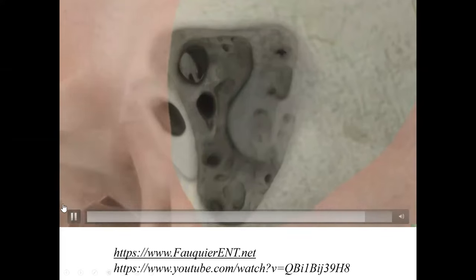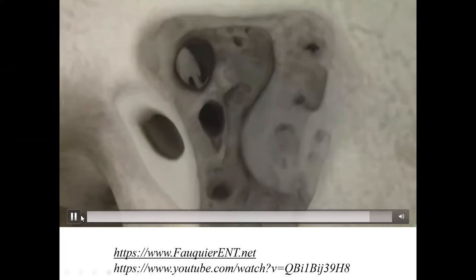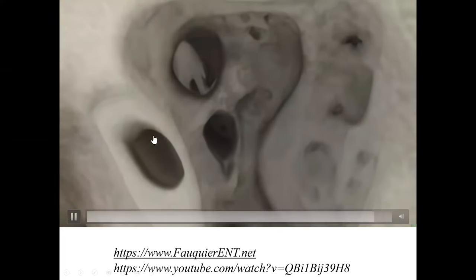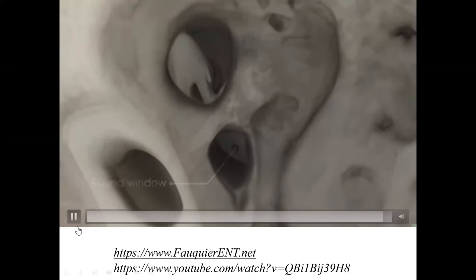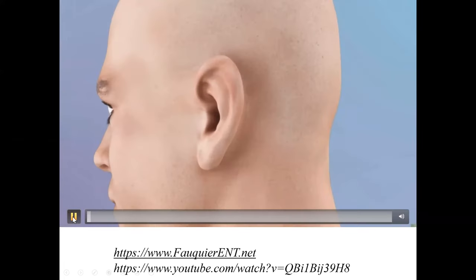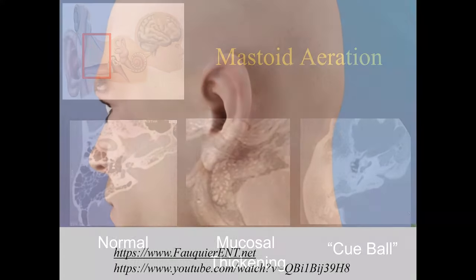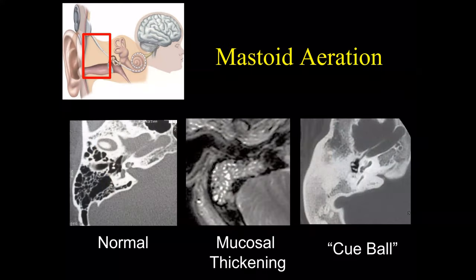At the level of the epitympanum we can see the ossicles of the middle ear cavity. At this level we identify the manubrium of the malleus and the short process of the incus. This is the approach that the surgeon takes.